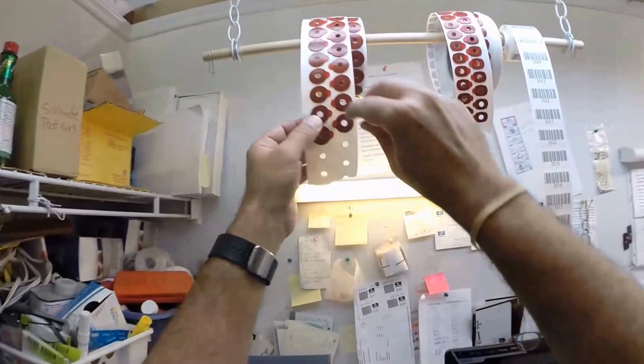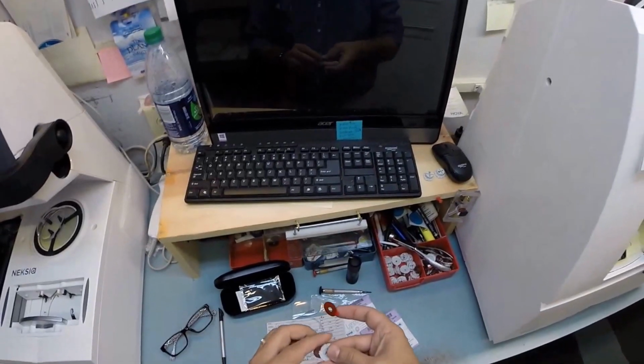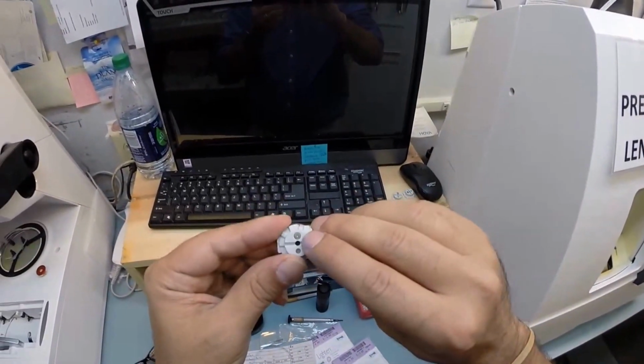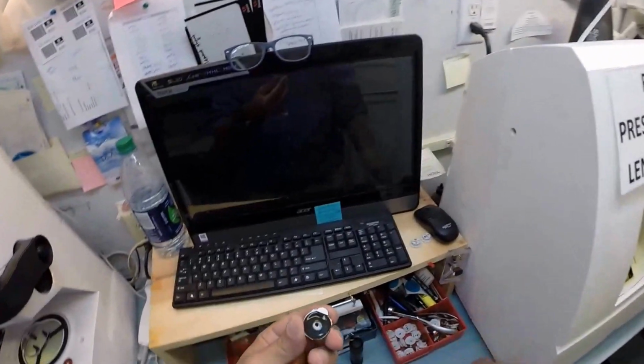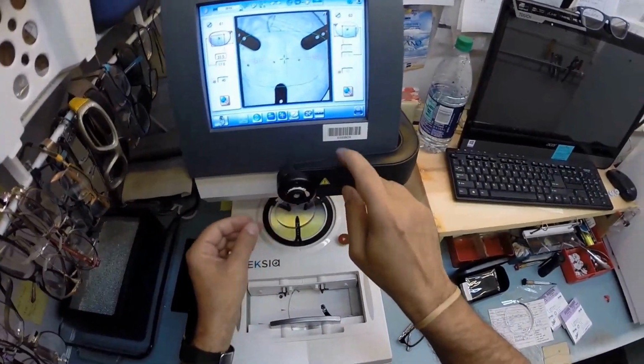So I need 2 double-sided adhesive stickers, of which I've got a couple of them up here. I'm going to take that, put it on the first one. Take that, put it on the second one. In fact, go ahead and put that on the platform. Now on the back is a little silver button. That is a magnet. It's going to do its job twice today. First time in just a moment, I'm going to pull the paper away to make the black side sticky. The magnet is going to hold it in place in the arm.